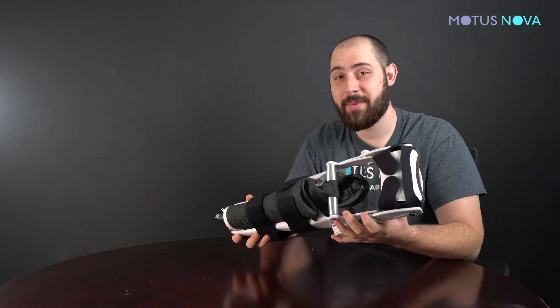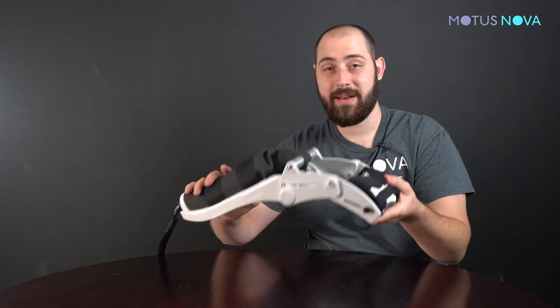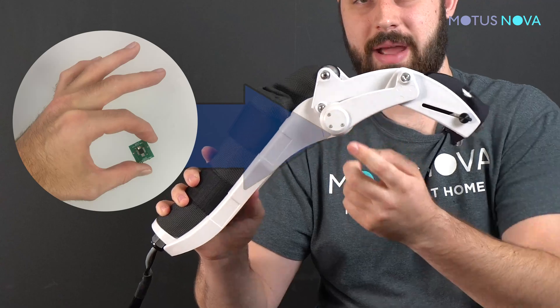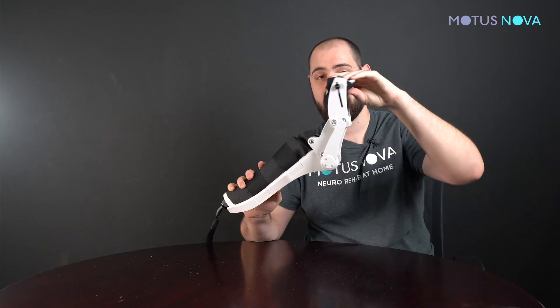Now let's talk about how the angle sensor works inside of the Motus hand. The angle sensor inside of the Motus hand is located in these bearings. It is in line with the wrist and measures that range of motion.